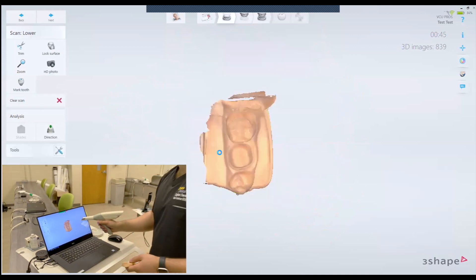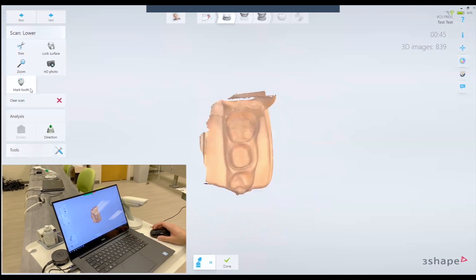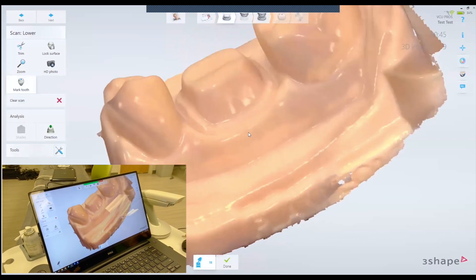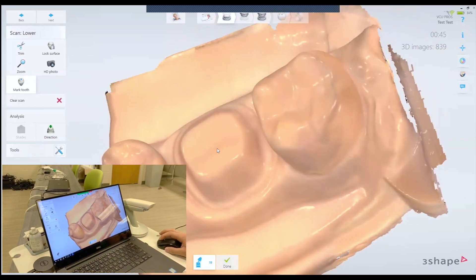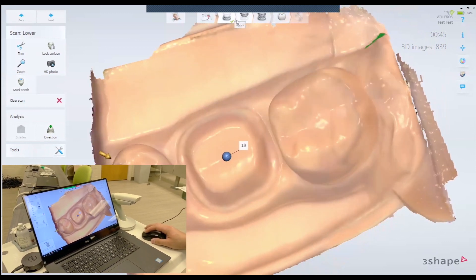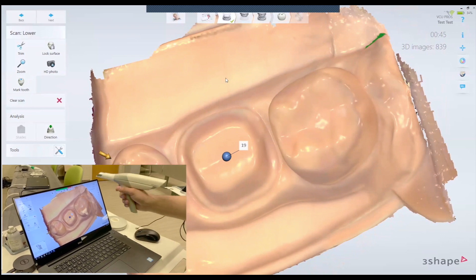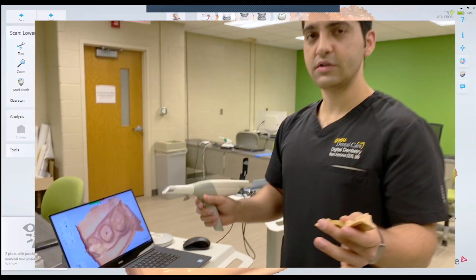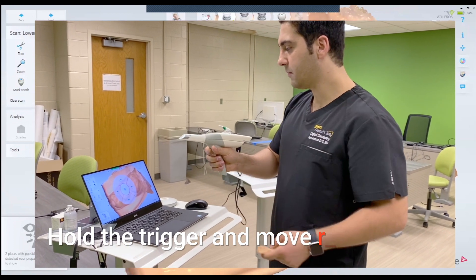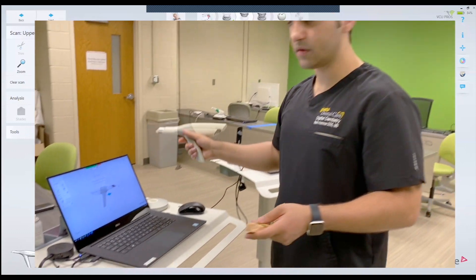Now we have the lower scan. The software is asking me to mark my tooth prep, so I'm going to click anywhere on my prep — I usually select the center of the prep. A better way to do this in the clinic, if you don't want to touch the computer, just click the trigger and hold it — this menu will pop up. Then move it to the right and release the trigger and it will take you to the next page.